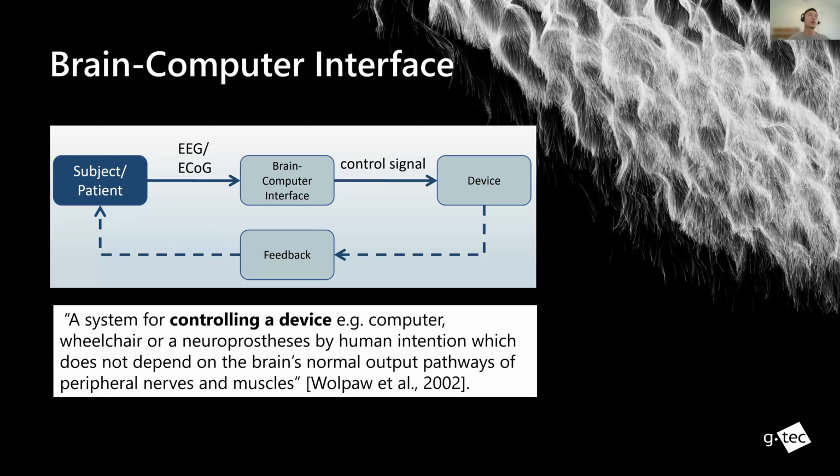The main thing for different amplifiers, of course, is brain-computer interface, collecting a signal from the subject, e.g., ECoG. But for today's talk, some people want to integrate different types of biosignals. So not just EEG or ECoG, could be, let's say, EXG or eye tracker, etc. Converting those types of signals, processing them through a computer, making them some type of control signal to control a device, providing feedback, forming a closed-loop system. So a lot of people want to do that.